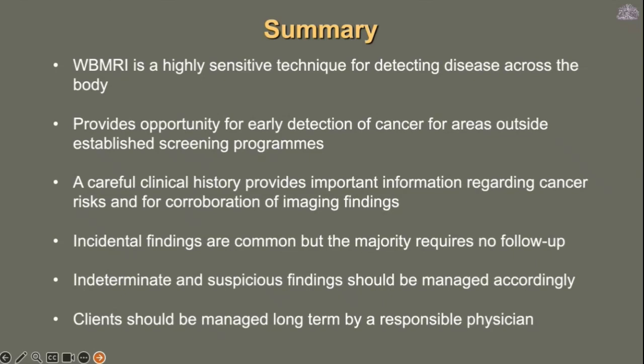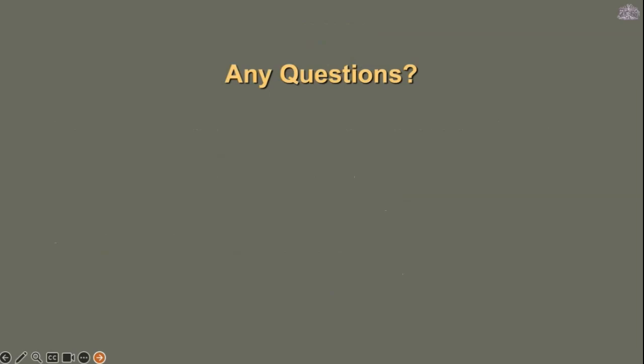Incidental findings are extremely common in this group, but the majority require no follow-up, and therefore we use the OncoRAD score to help support decision-making. The indeterminate and suspicious findings should be managed accordingly, and we always believe that we are only part of the patient journey, and clients should be managed long-term by responsible physicians. So I'm just going to end there now and open up to a conversation with all of you, with myself and Anwar.